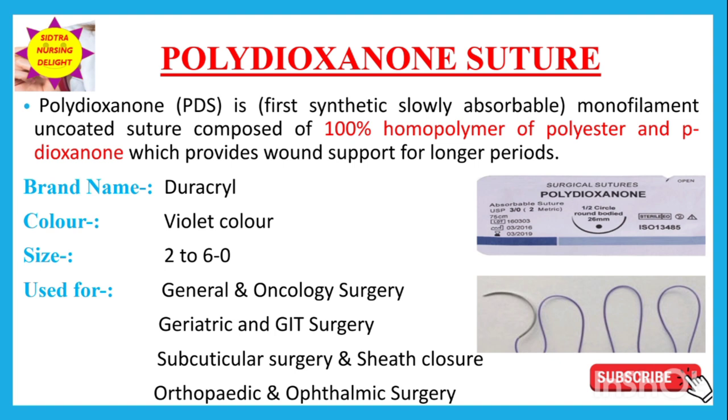In this video, we learnt about types of sutures and absorbable sutures in detail. In the next part, we will discuss non-absorbable sutures and their uses.